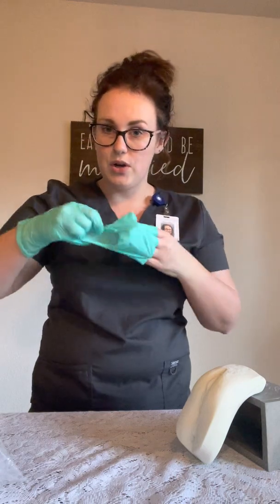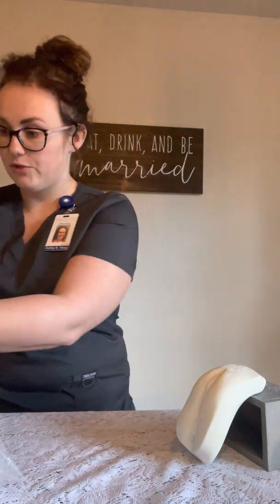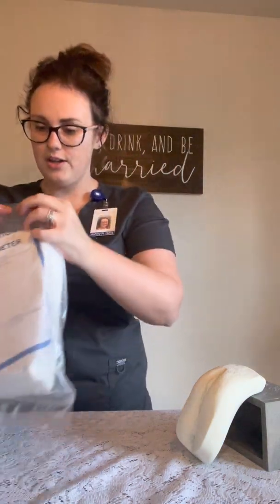I'm going to remove my gloves and perform hand hygiene. All right, and then while my patient remains in this position, I'm going to open up the catheter.